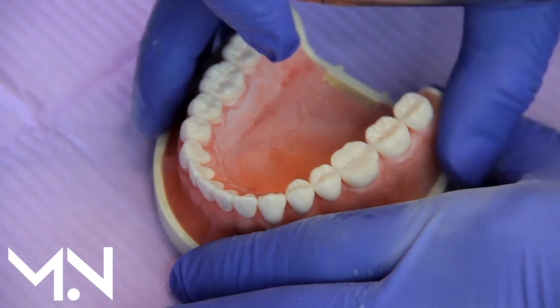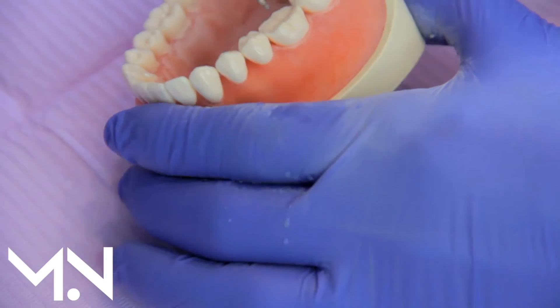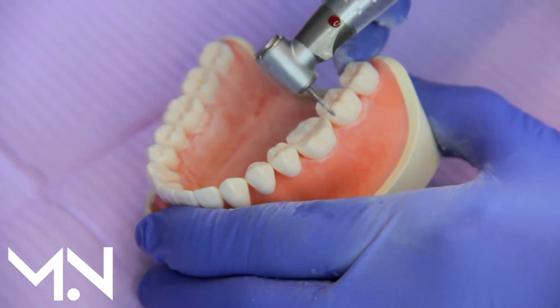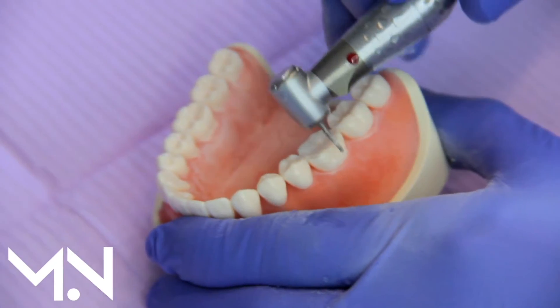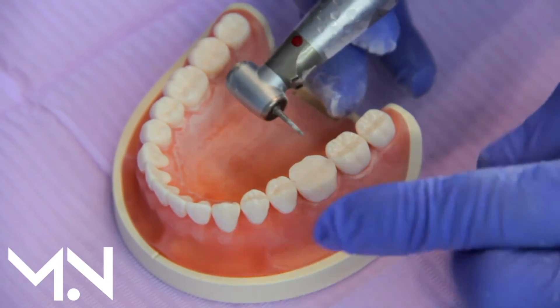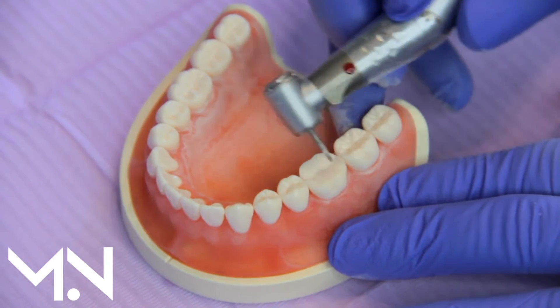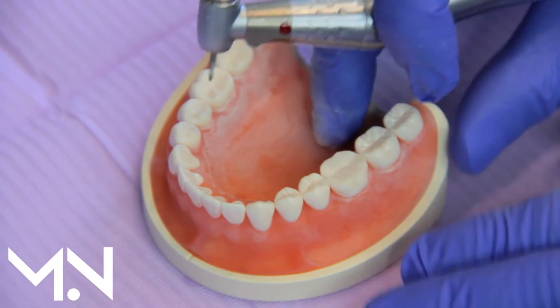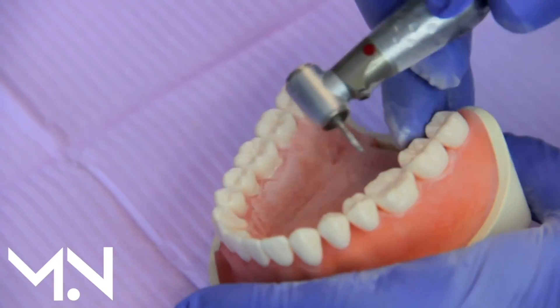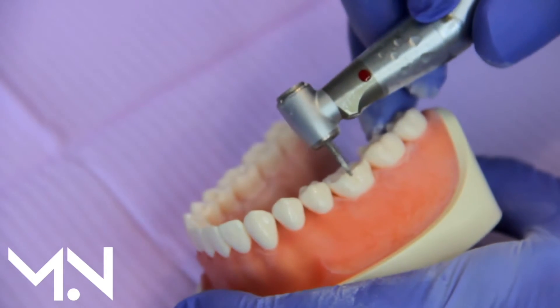From the side you can see how much reduction we have. Now I need to reduce the sides, because the crown covers the top and all around. To strengthen this tooth we have to take away not only a lot of the top but also the sides. This is what we call the axial reduction.